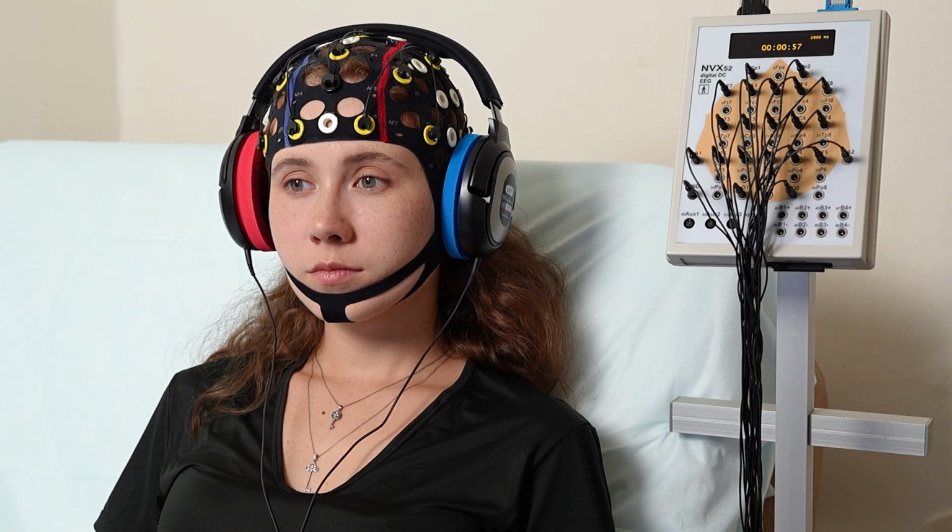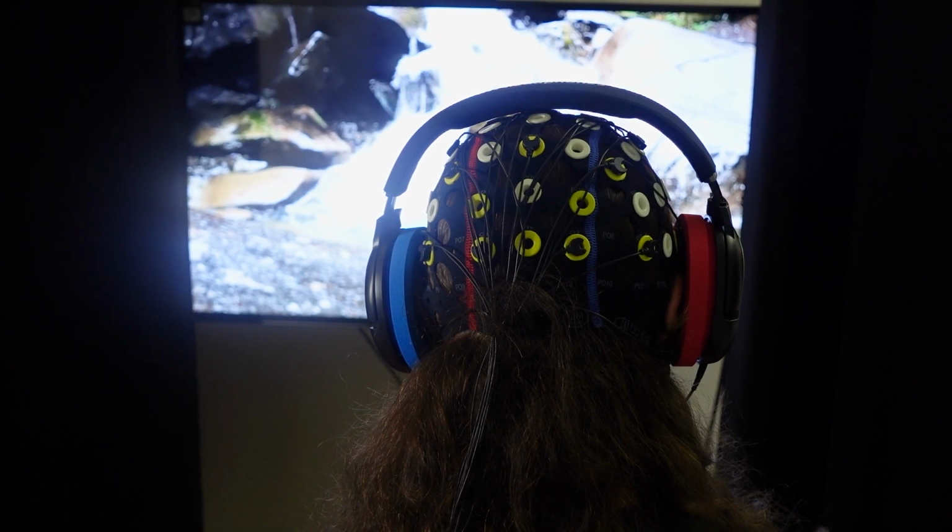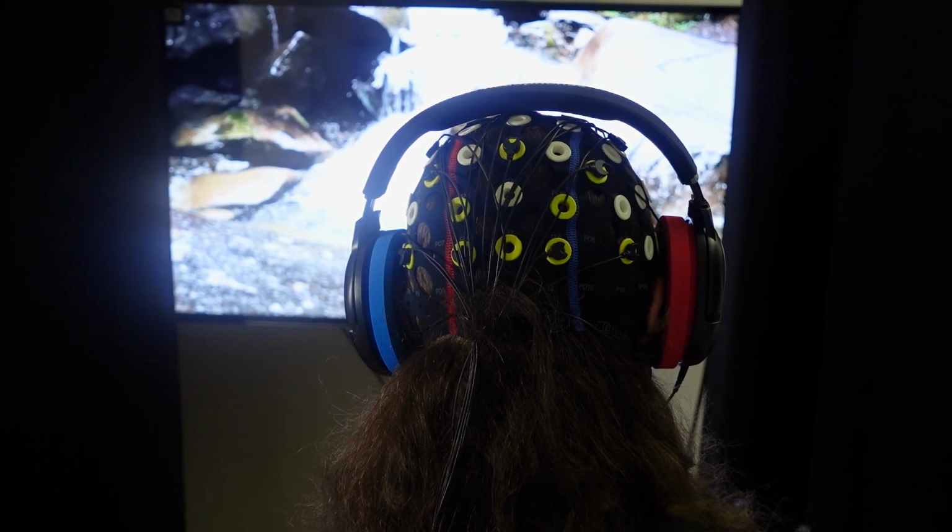Now the lowest tones, the standard stimuli, will be presented most often. Periodically, they will be interrupted by one of the deviant stimuli, a higher frequency tone. We would like to remind you that our participant does not have to perform any special actions or to focus on these sounds. On the contrary, we distract his attention by showing a video on the patient's screen.